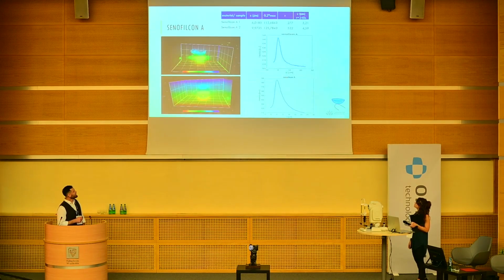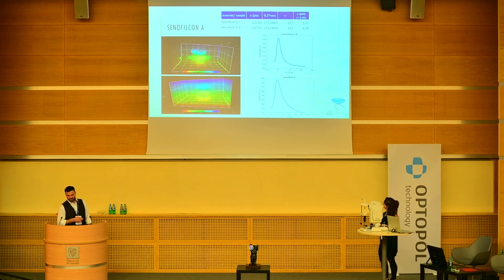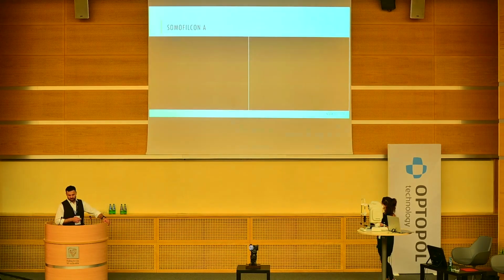However, here is the representative of the most common morphology of the lipids that we found on the lenses, and this one, which attached much later, so the time for the diffusion was much shorter, still has a totally different morphology. And we don't know what happens next. Maybe it will attach more to the lens surface.